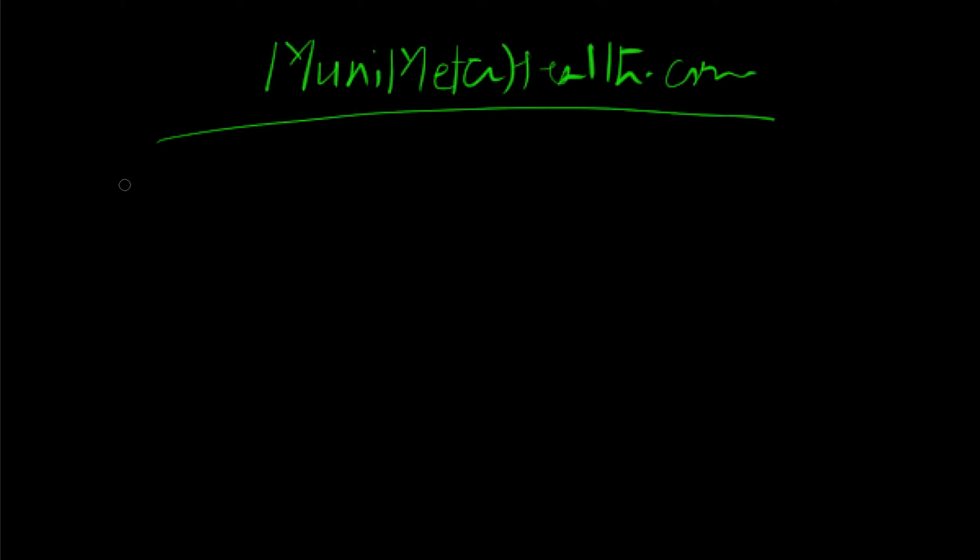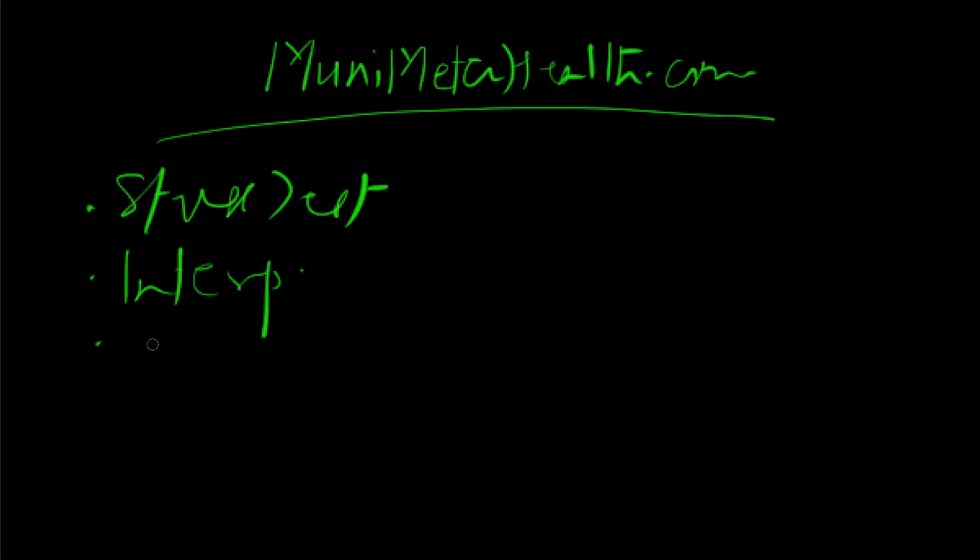So basically I'd like to tell you the fundamentals of a stress test first: what a stress test should be and how it's performed. Two, how do you make an interpretation? What are the key things that you want to make an interpretation from? And then how do you write a report? So the whole talk will be divided more or less in three parts. As we go along, let's start understanding how we perform this test.